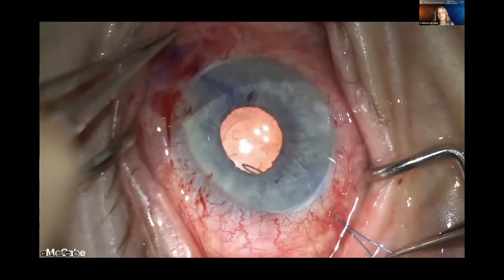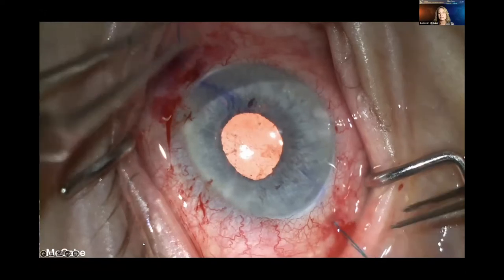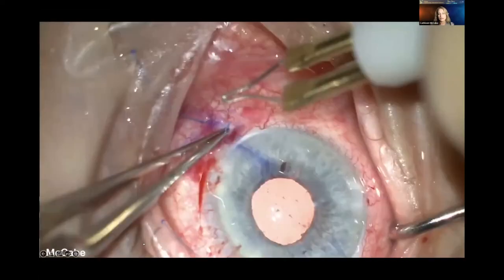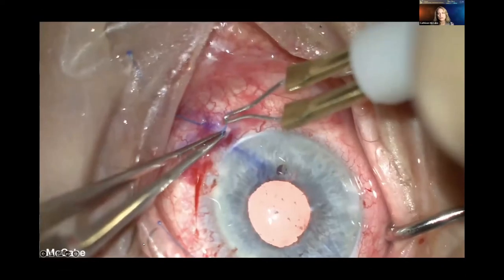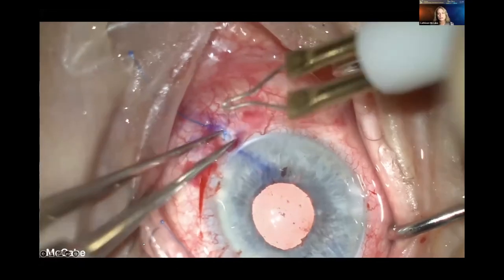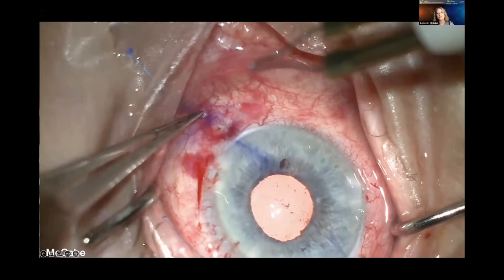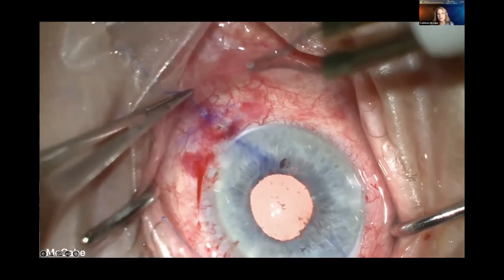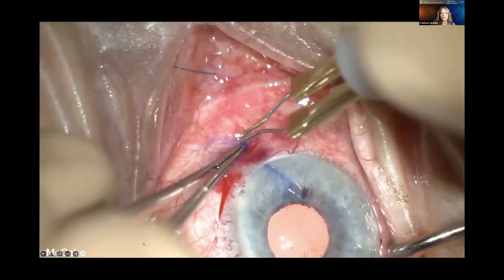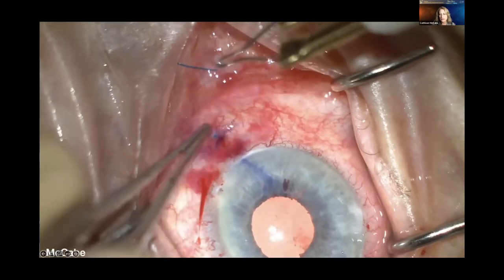The part of the surgery that requires some finesse is making sure you've externalized enough suture that there's light tension on the haptics. You don't want to bend them straight, but light tension that supports the haptic on either side to center the lens very well. Now I create just a small flange — one that will easily embed into the superficial sclera with less risk of erosion. I want to make sure it's nice and flat and buried, to reduce the risk of endophthalmitis, which has been reported with flange techniques including the Yamane technique. These are very stable lenses once all of that is done.